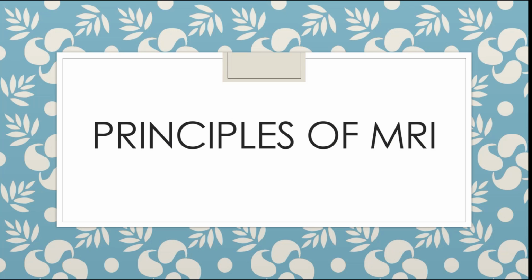Do you guys have any questions about ultrasound? I know for ultrasound, there's also the A mode, the M mode, and B mode, but we rarely use them. I think you just need to know them in theory. We mainly use the B mode. So, any questions for ultrasound?